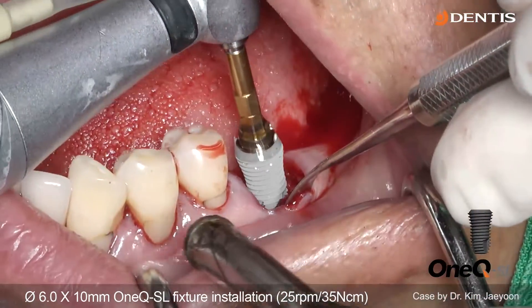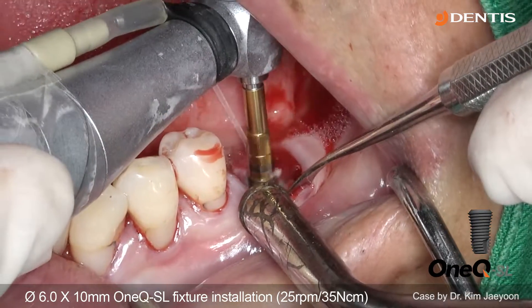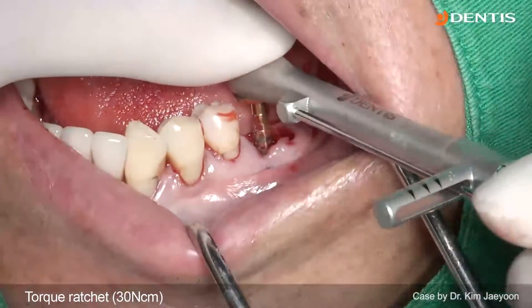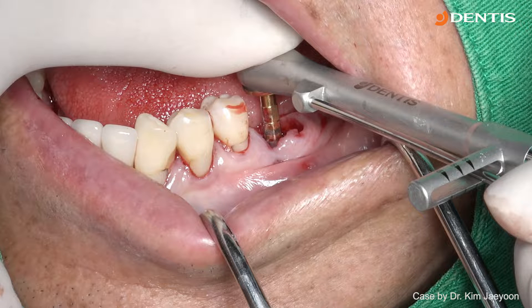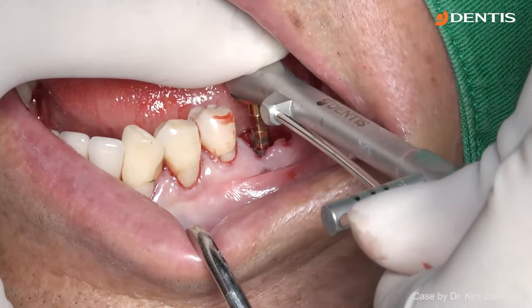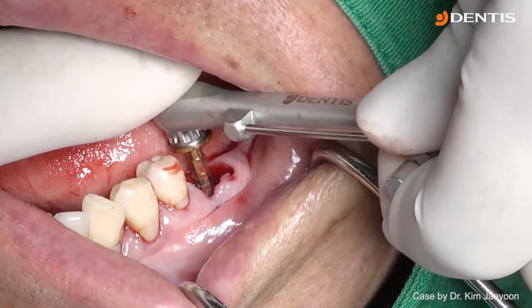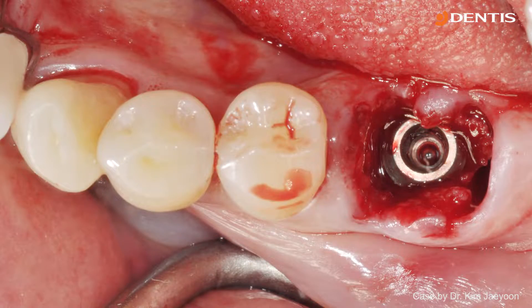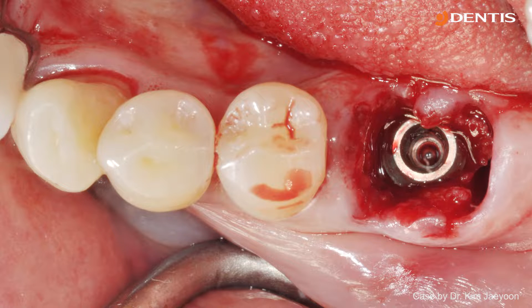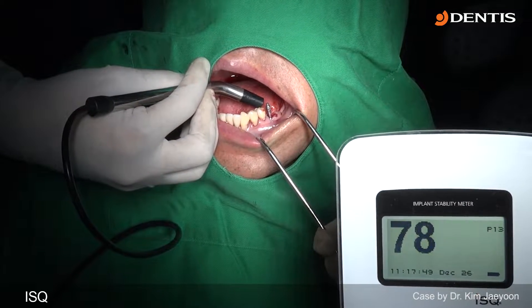In the same way, I place the implant in the same site and the same direction as I drilled. 90% of placement is done with engine-driven insertion, and the last 10% I always use the hand wrench to feel the final torque of insertion. The depth is about 1 to 2 millimeters deeper than the bone level. I check the ISQ value measurement — the value is good.